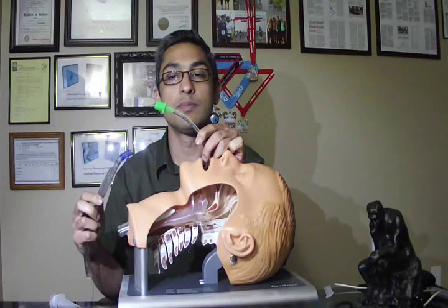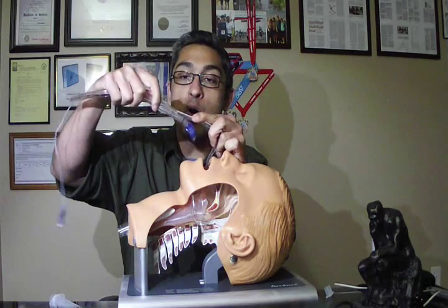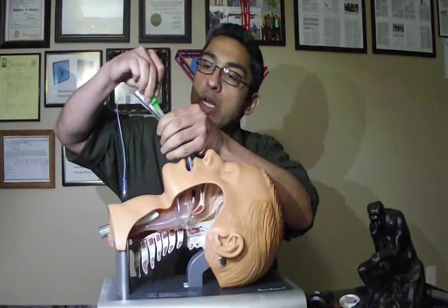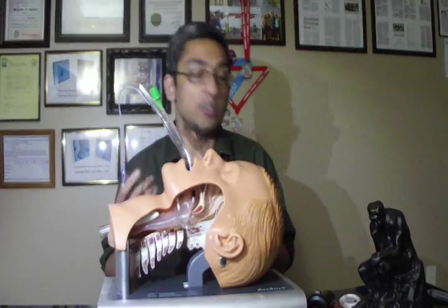Since I am not a biomedical engineer, my prototype does not have a 9 mm diameter opening for the patient's ET tube or for a proper size ventilator tube. So I will be demonstrating the rest of the procedure with a smaller size 5 pediatric tube. The second anxiety-producing step is to disconnect the patient from the ventilator and quickly put the viewing apparatus onto the patient's endotracheal tube. As soon as it comes out from the other side, quickly put the ventilator back. Once you have achieved this step, there is no more anxiety associated with this procedure.